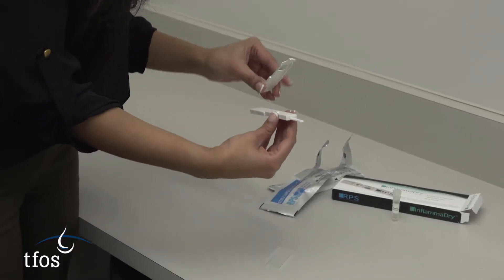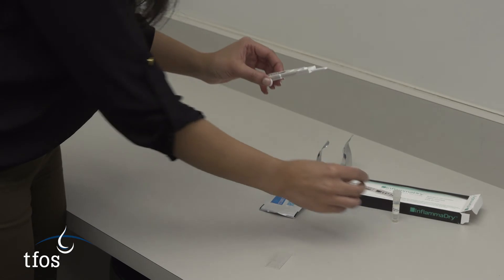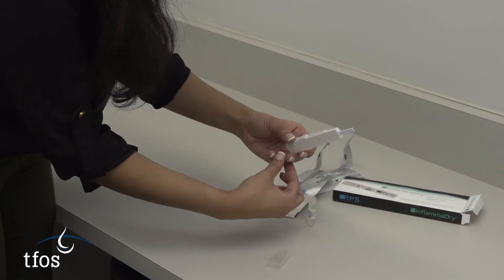The test card is then clipped into the plastic holder, and once a protective plastic cover is removed from the tip, it is dipped into the solution provided for 20 seconds, or until a purple wave is seen in the results window.